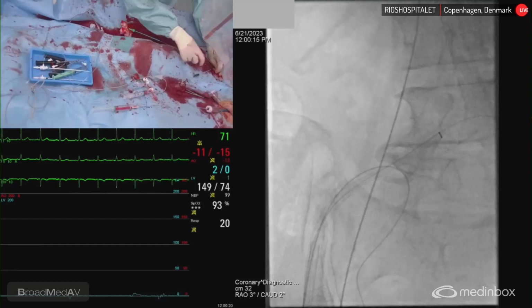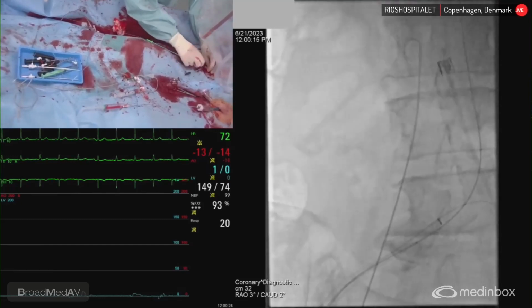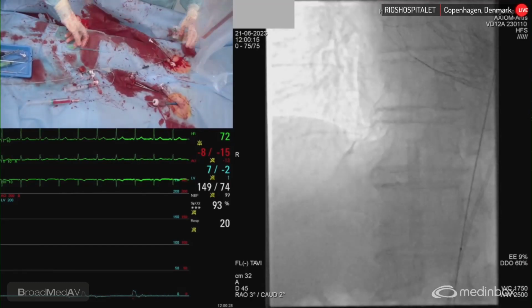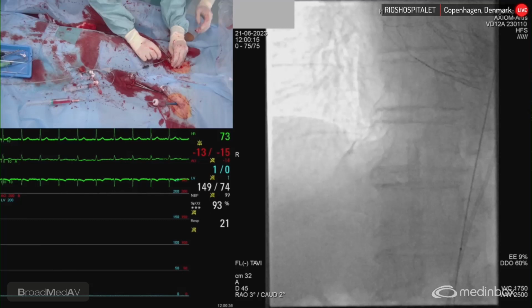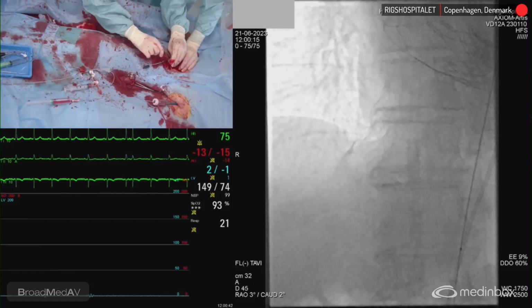ECG in the meantime, we have quick nurses here. PR is normal, QRS is normal, 116. So QRS is narrow. So for sure, no pacemaker for this man. Okay, you take it out. 10 French, please. I'll compress. 10 French. All right, let's get in with the temp.